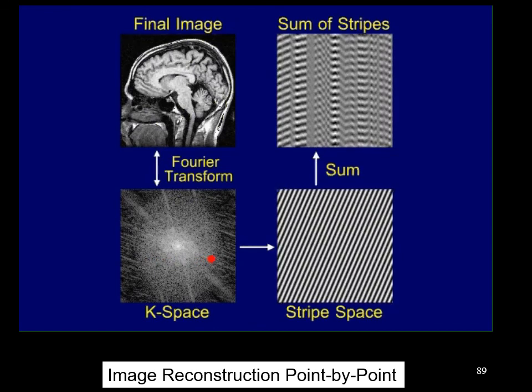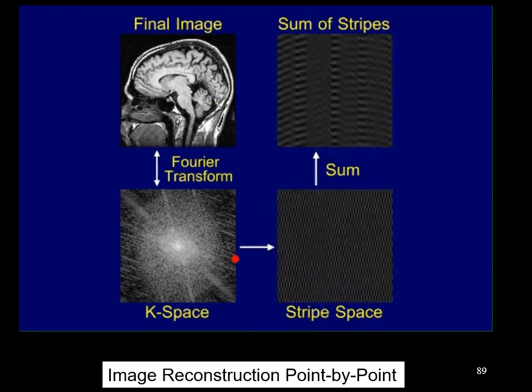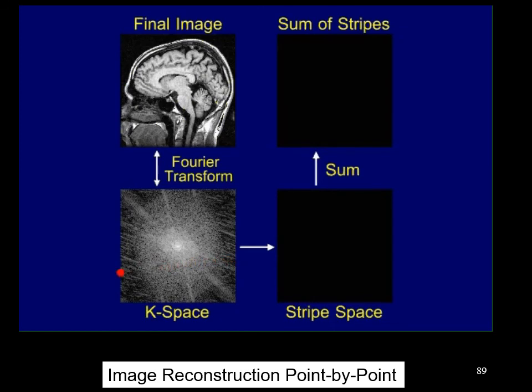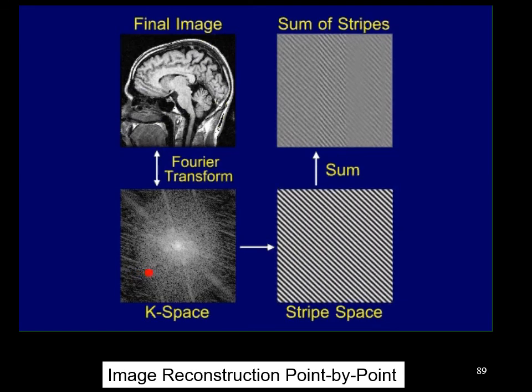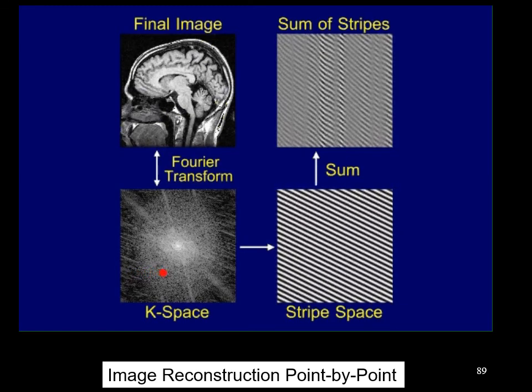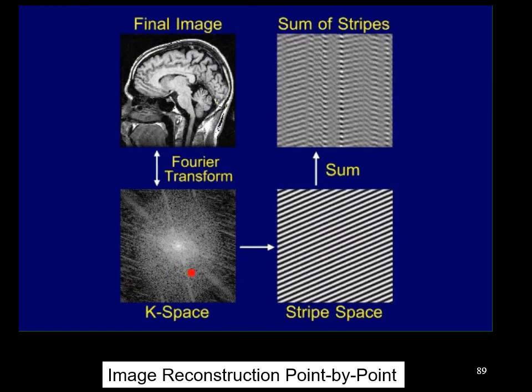We now turn on the Y gradient, and now we have a series of oblique stripes. We can see them being added to the image in the upper right-hand corner. The obliquity reverses as we cross the origin, and the frequency of the oblique stripes gets greater and greater.